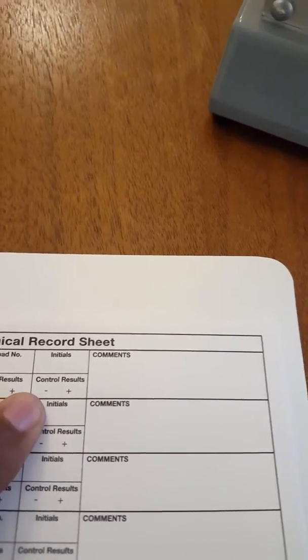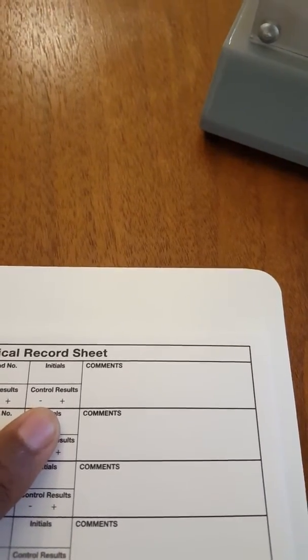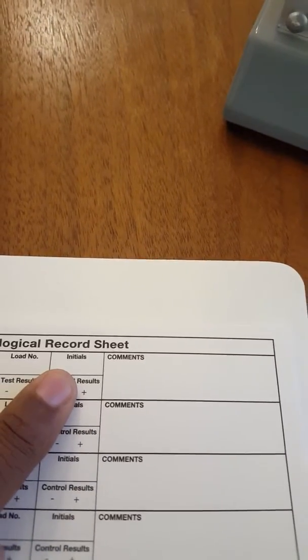And then the control should always show up positive. So being that it changed colors as I showed you previously, you want to circle the positive that's there, and then you'll initial.